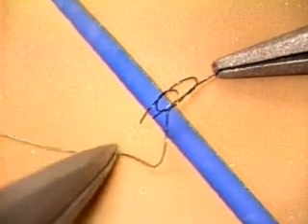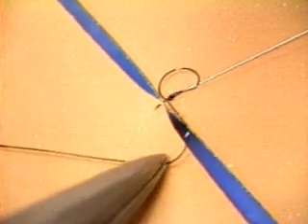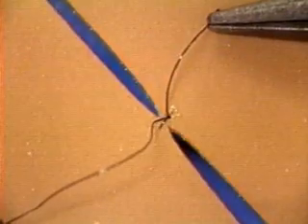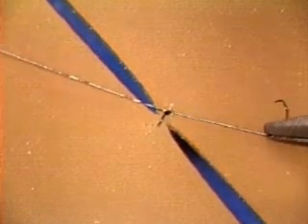Leaving the long end slack, pull sideways on the short end till the first half knot comes just tight enough. Then pull the long end over and tighten the second half knot. There's your square knot completed. Put one more half knot on top of it for security, and the job is done.